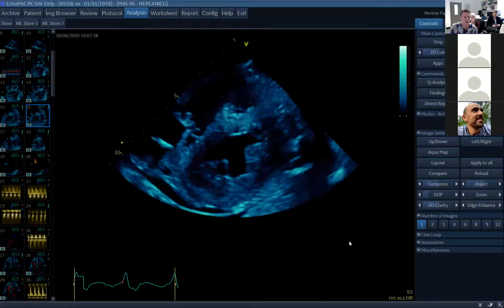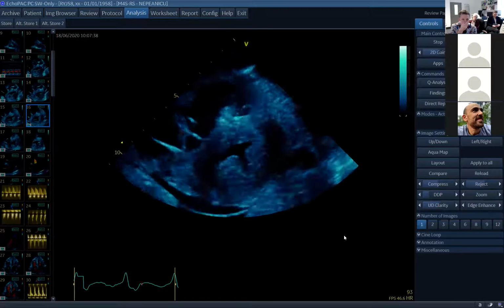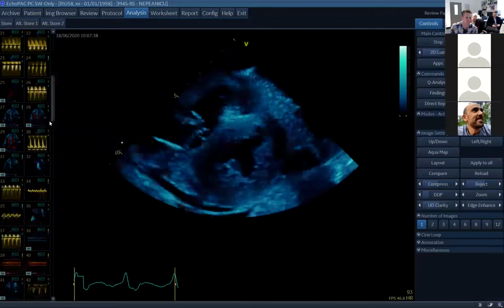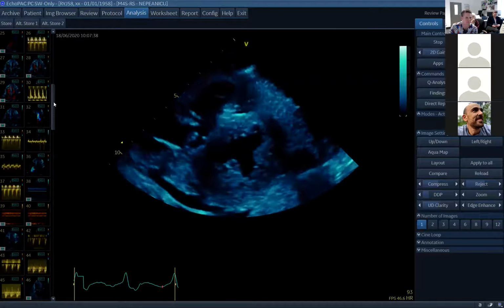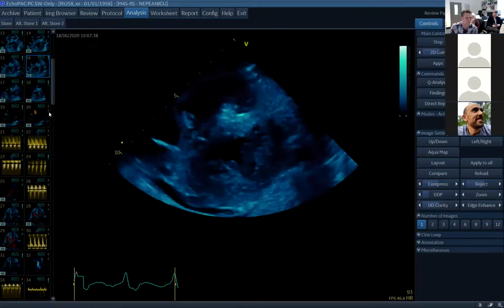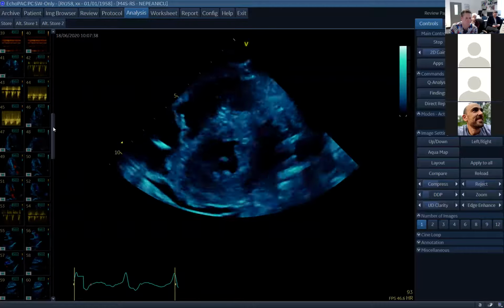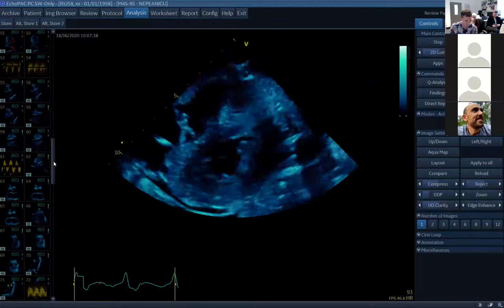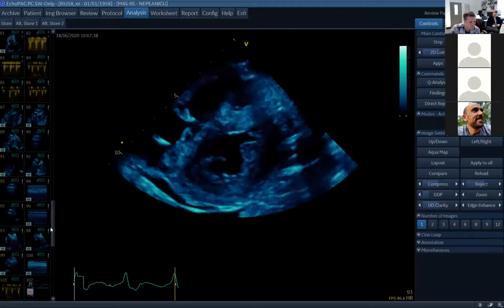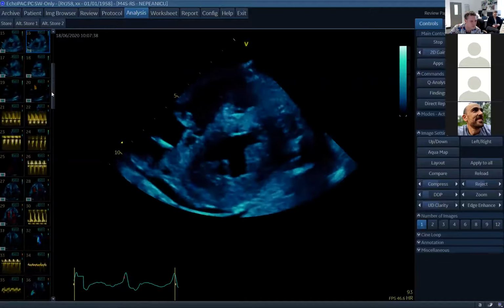Okay, so we've got a parasternal short axis view at the level of the papillary muscles. We can see on the top left of the screen the tricuspid valve and the right ventricle anyway. The tricuspid valve, just interestingly, doesn't look normal to me. It doesn't look like it's opening widely. And I can see a bit of the pacing wire again in the right atrium. Be nice to put color flow on there and pulse wave Dopplers in both directions.